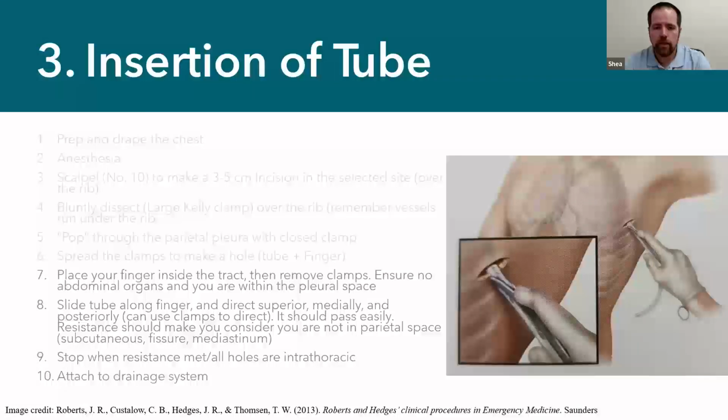You've got your finger in there. And the other important reason we're doing that is to keep that tract, especially if the patient has a lot of adipose or additional soft tissue. That tract can get lost pretty quickly. So you really want to leave something all the way into the pleural space the whole time, so it's never left alone. You have your finger in there.